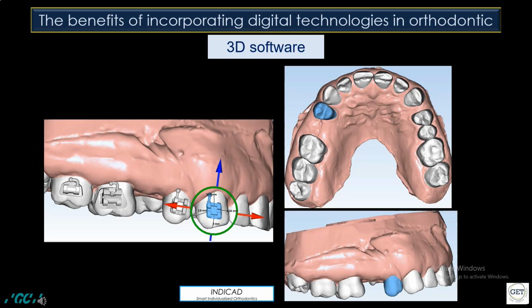In an upper extraction case, the bracket position can be adjusted in order to compensate for the expected side effects, such as rotations and tipping, and to control the torque loss in the respective bracket system and the wire size to allow the optimal tooth movement and best final position and result. It is important to accentuate that those calculations will be different for different types of brackets according to their physical dimensions.